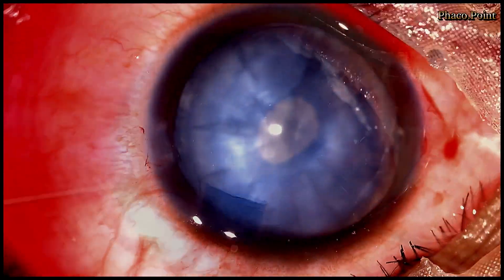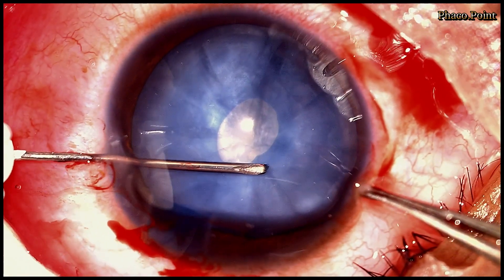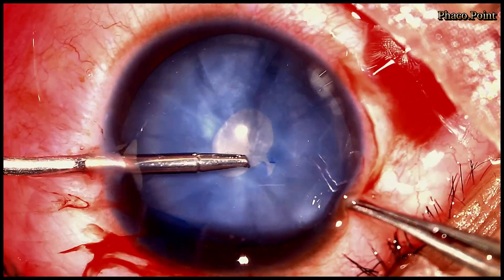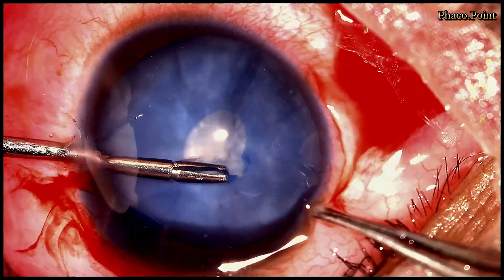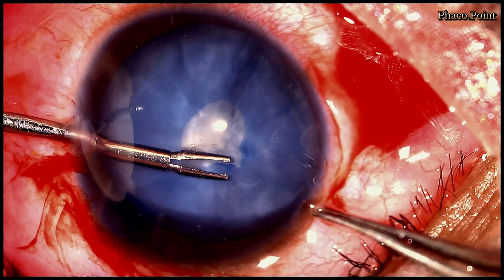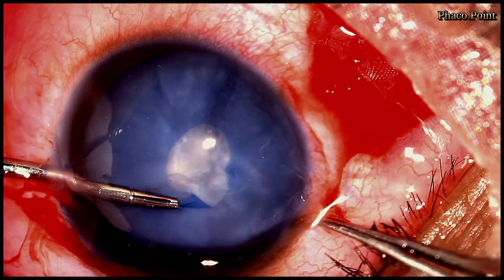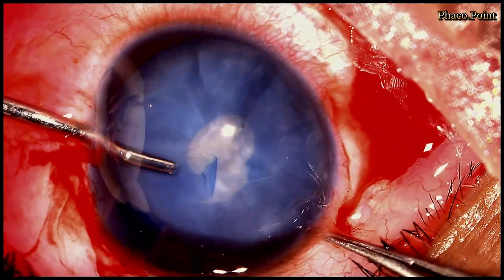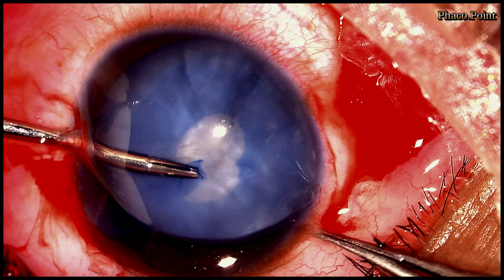Once more, I insufflate some dispersive viscoelastic into the eye and with the help of a cystitone I make a tangential nick. Then with the help of an intraocular forceps, one of the torn edges is held whilst the eye is being well supported with the help of a limbus forceps. I then proceed to create a second circular rhexis larger than the first, which will allow me to complete my phacoemulsification procedure with ease.